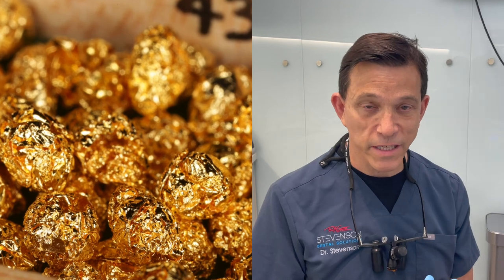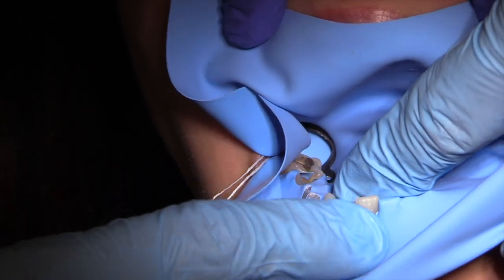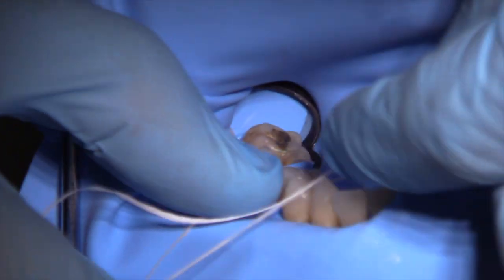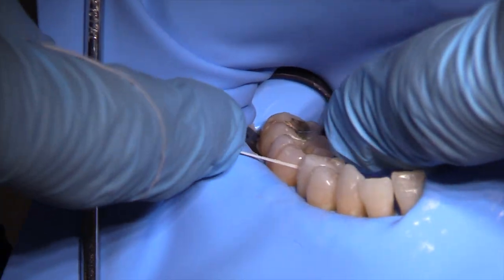Wish me luck. As always, we start with rubber dam isolation. I'm using a W2 clamp on the second molar and a Nic-Tone blue medium weight rubber dam. I like this rubber dam because it photographs really nicely. When inverting between the teeth, I make sure the floss is always between the rubber dam and the tooth, and I hug the tooth to invert the rubber dam. Done this way, we will not need any individual ligature ties.